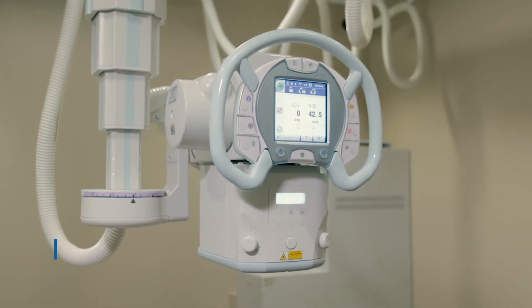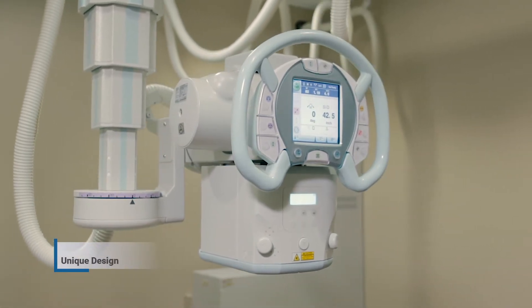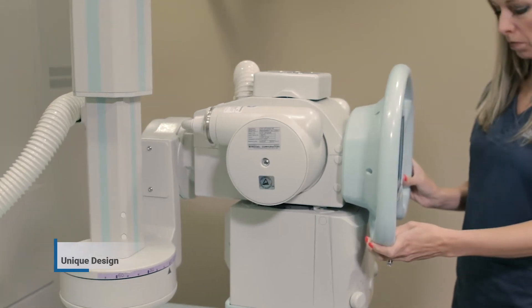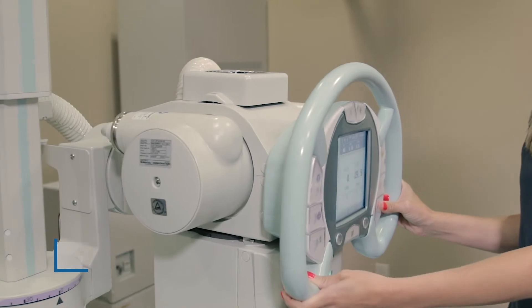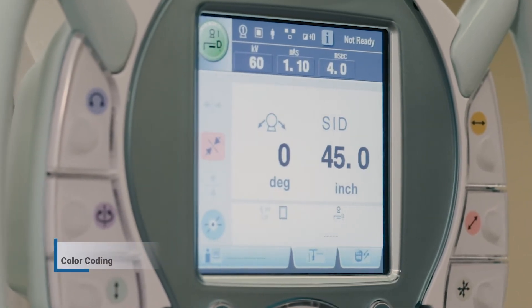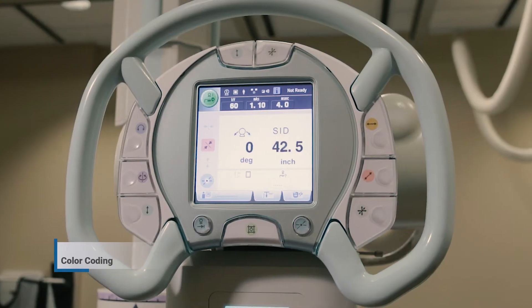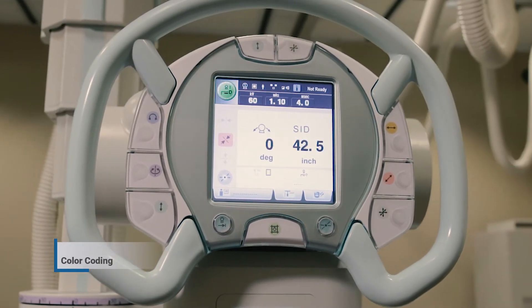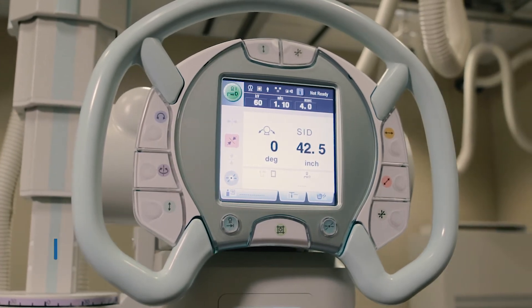The first thing you will notice about the RadSpeed is its unique ergonomic steering wheel shape. Shimadzu does a great job of placing buttons in a comfortable location for the technologist while maximizing workflow. Another helpful feature Shimadzu utilizes is its color-coding sequence, which allows the technologist to see the color associated with the button or movement needed to position the equipment easily and comfortably.